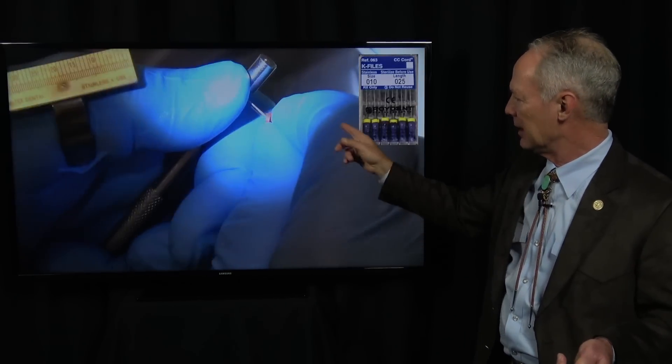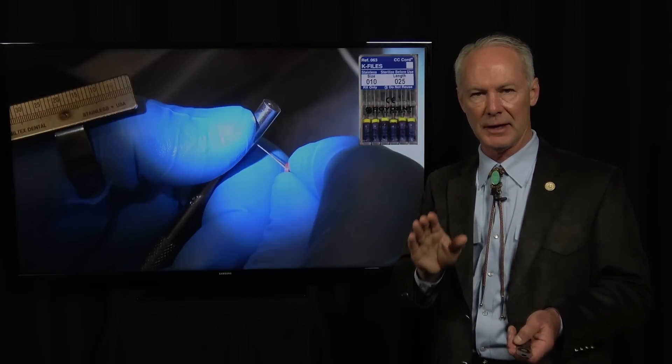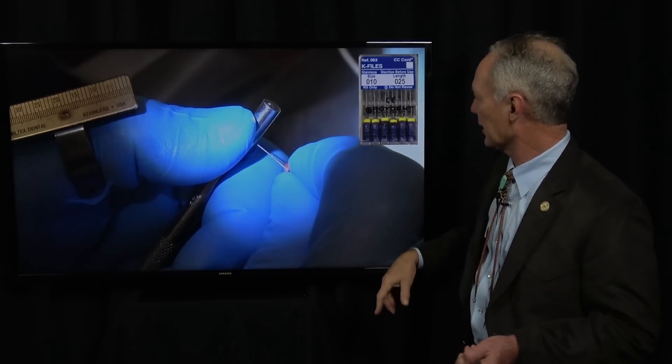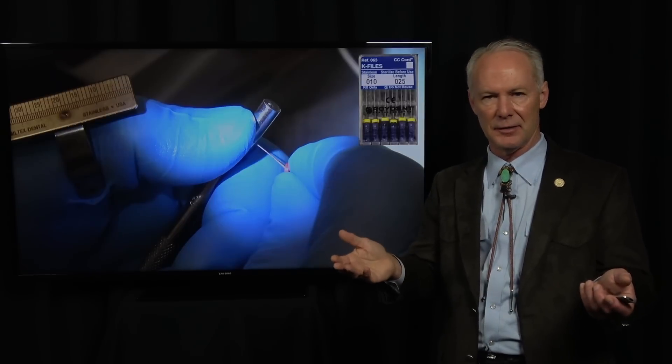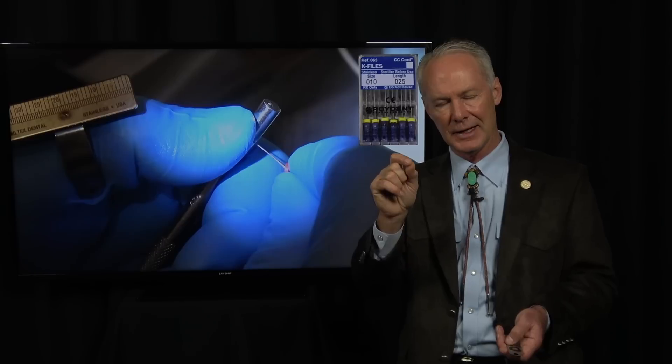These are hand files — K-type and Hedström. This is something very important: don't forget this. The first part of the procedure should be hand filing with either a K-type or a Hedström, size 10 or 15. You want to clean out the apical part of the canal, because anybody using rotary drills is from time to time going to have a separated file. If you haven't cleaned and irrigated the apical part of the canal prior to separation of the file, that's a significant problem.